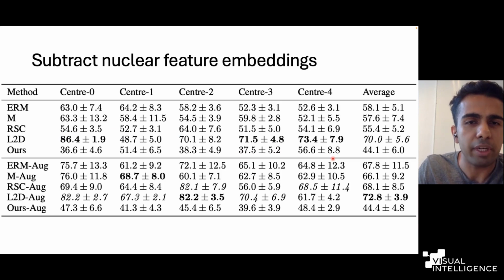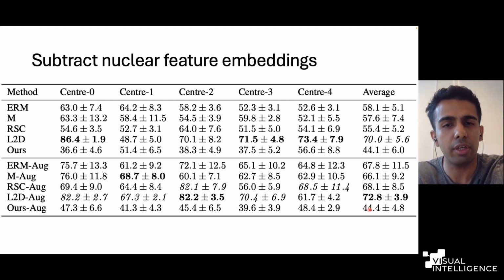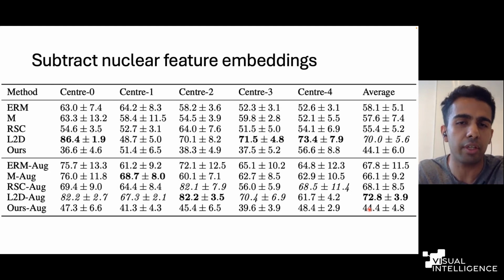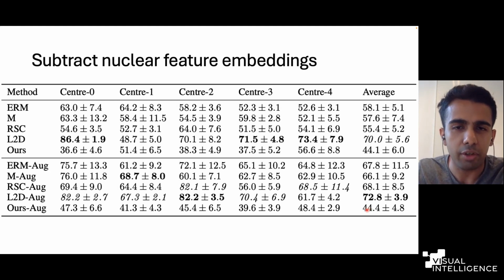What we expect is for the accuracy of our method to go down a lot, which it does. It goes down to below 50%. 50% is, by the way, what a naive classifier would get, because in our data set we have exactly 50% tiles that are tumor, 50% that are not tumor. So if you take a classifier that classifies everything as only tumor or non-tumor, you will get 50% accuracy. So our method is really bad here.